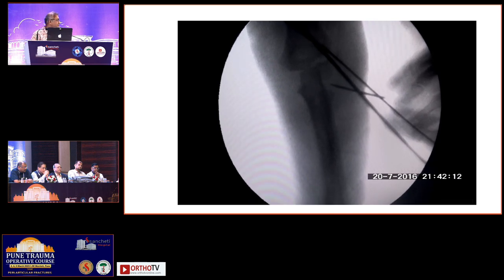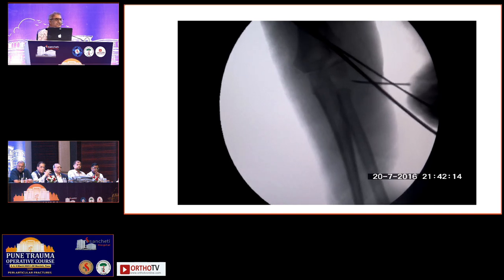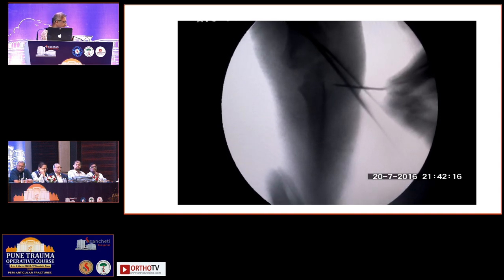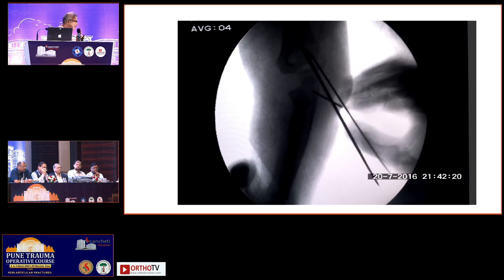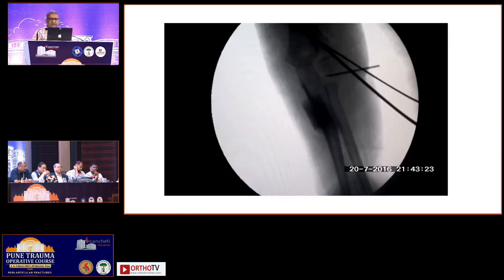What you see by injecting air means resistance. It's an empty 5cc syringe, where you will push the air inside. So it's not like giving a spinal, but this air will actually delineate and make sure that your needle is in the joint and not somewhere else. So that is how that is done.